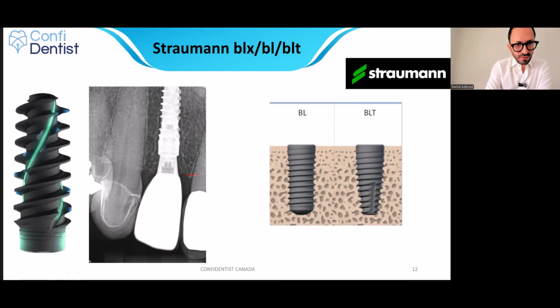This is the bone level. You can see the implant was placed subcrestally, which we do very commonly in cases of immediate implant placement. This is the platform switching. Look at this step. Okay, platform switching. This is a narrow implant which was placed at site 1, 2.